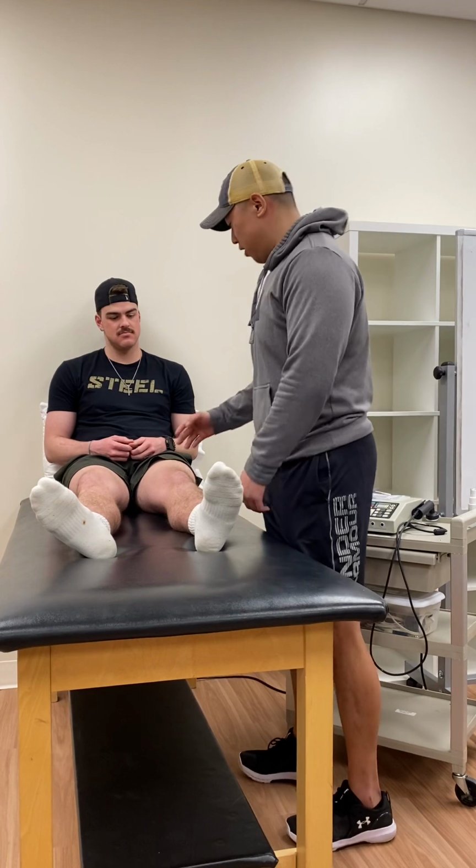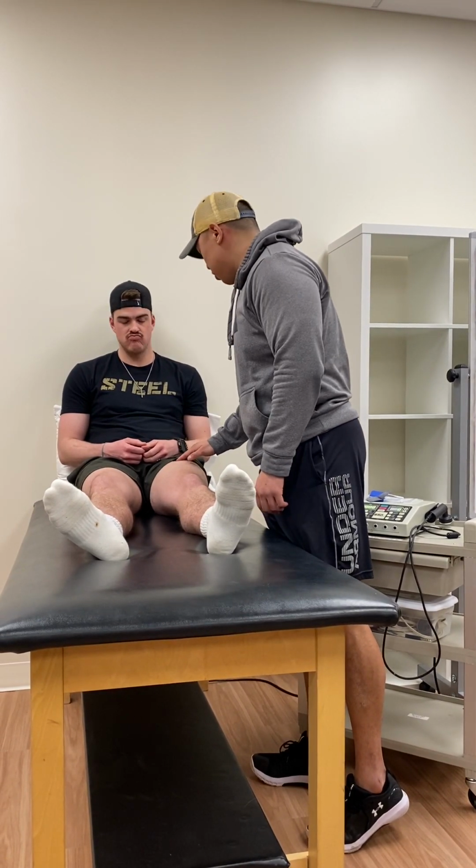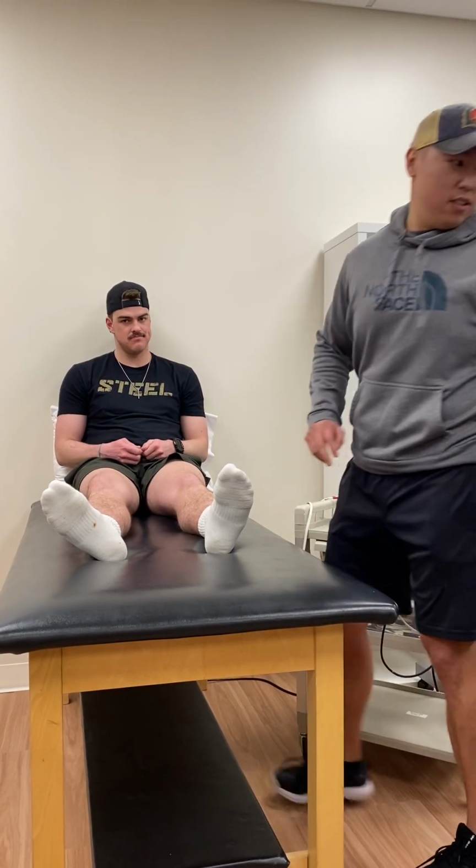And you don't have any history of epilepsy or cancer, DVTs or anything? All right, perfect. I'm just going to inspect the skin. All right, everything looks good. You don't have any impaired sensation, so everything you could feel, I'm pressing down, everything feels good? Yep. All right, perfect.